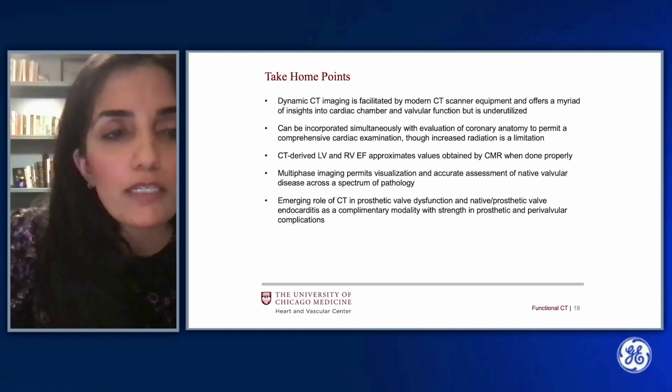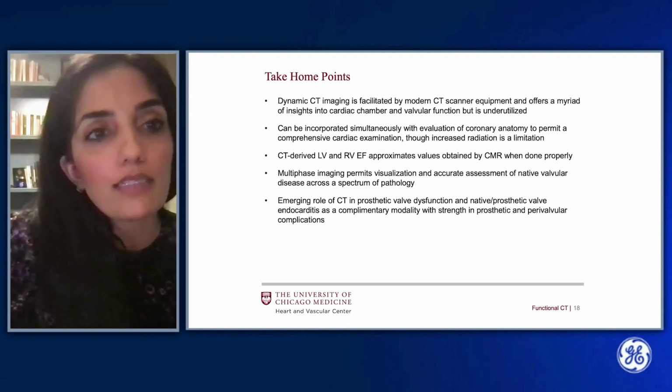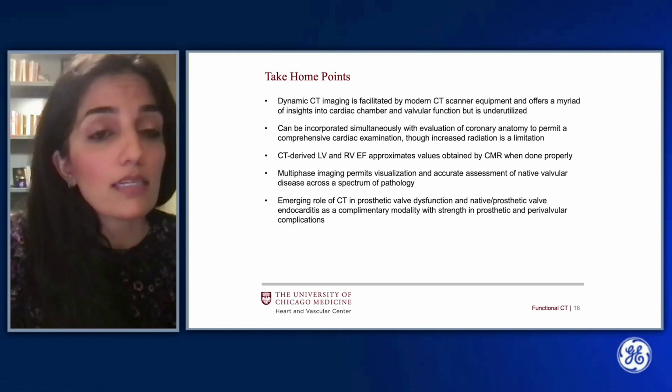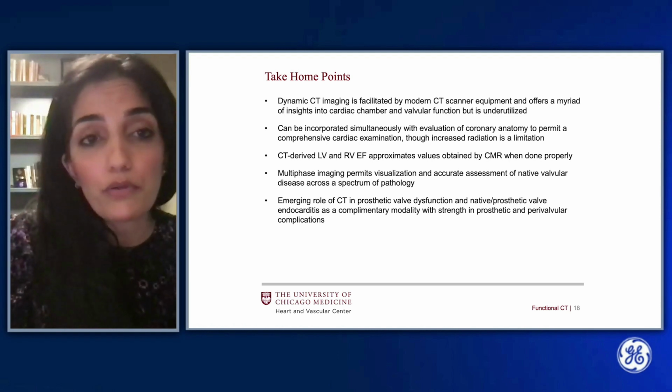So in conclusion, some take-home points, which hopefully I've emphasized in the last several minutes. Dynamic CT imaging is facilitated by modern CT scanner equipment and offers a myriad of insights into cardiac chamber and valvular function, but sometimes goes underutilized.